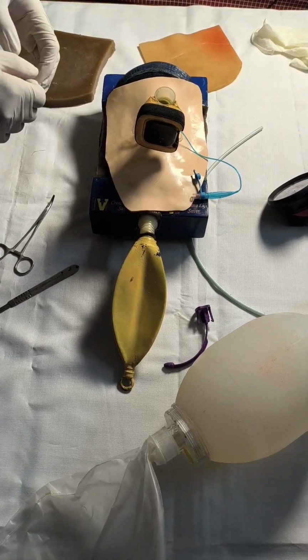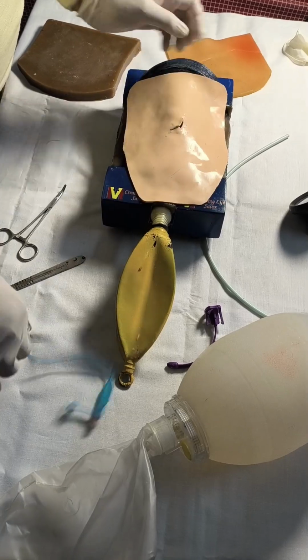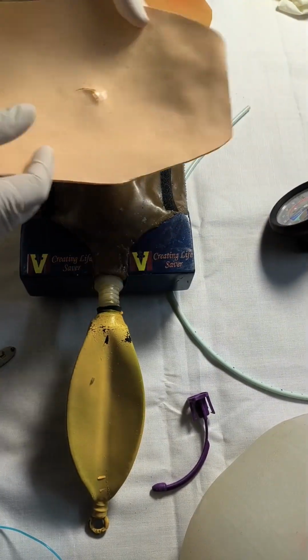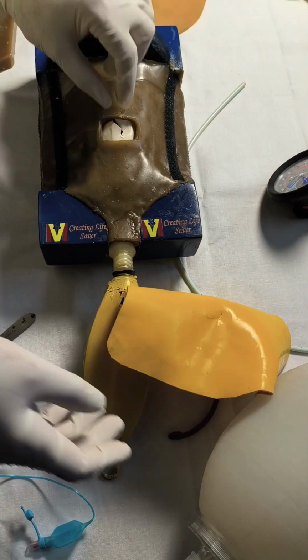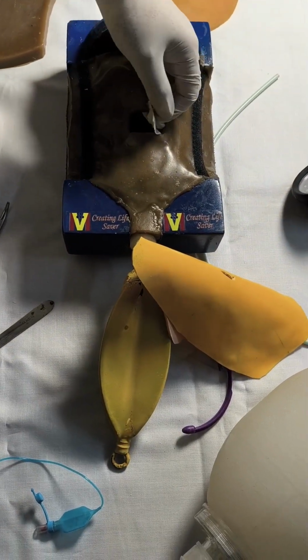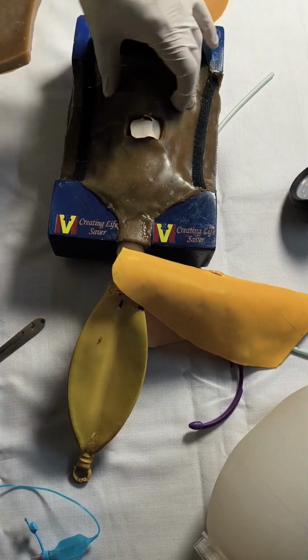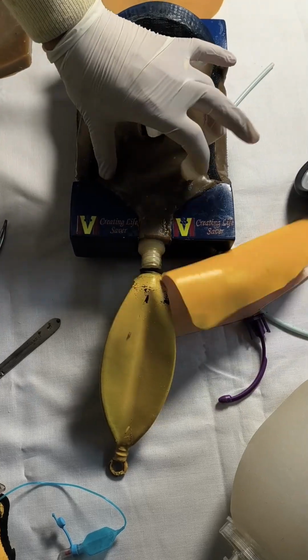Thank you very much. Now I will explain the mannequin. This is the skin. You can use it multiple times by rotating it, and this is the cricothyroid membrane. You have to replace it. This is very low cost, and we have used a substance which mimics human skin.